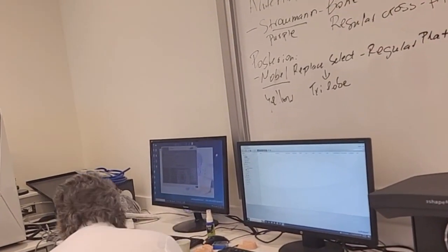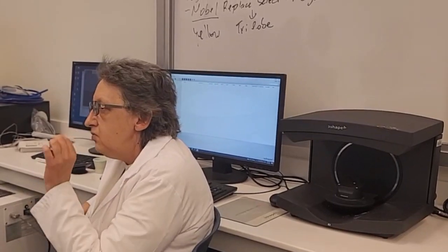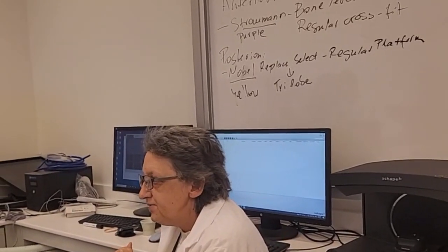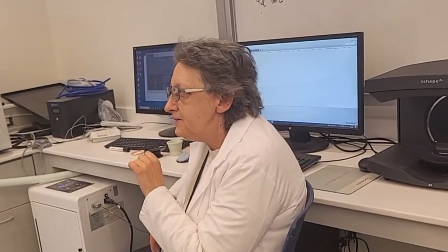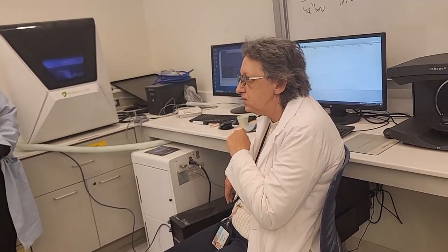When we start doing the custom abutments for our anterior, remember we've been talking in the lecture about the design for anterior custom abutments, what they should resemble, what they should look like. Crickets, crickets. Think about if a doctor prepares an anterior central, how that preparation looks versus when they prepare a molar.